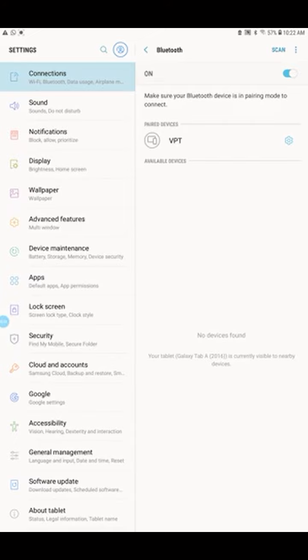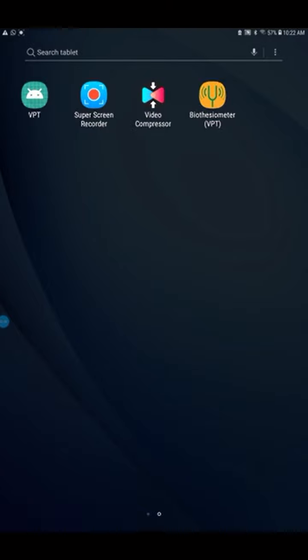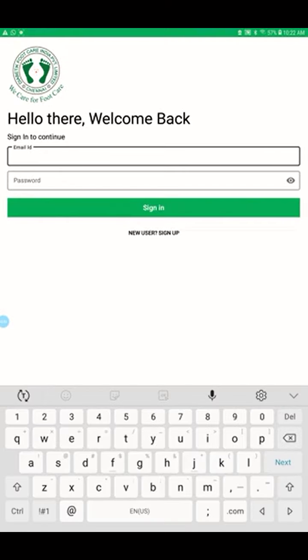So now we will go to the application. You can see here the Biothesiometer VPT. The tuning fork symbol is there. So you select that symbol. So it asks for signing in, but since you are doing it the first time, we need to do the new user sign up. Okay, so we do the sign up.